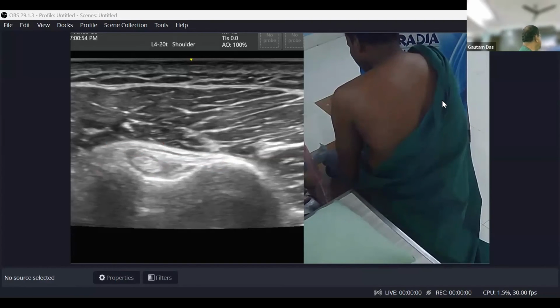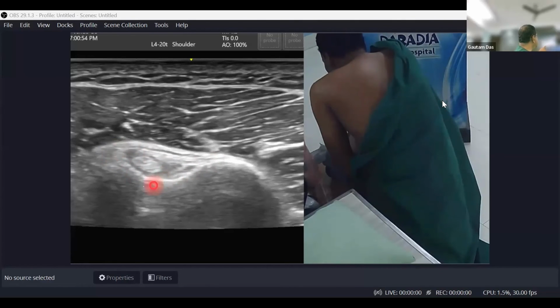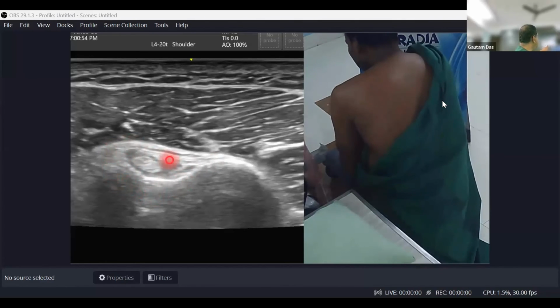And if we have bicipital tenosynovitis, or a lot of fluid collection or effusion inside the glenohumeral joint, the synovial sac projects out into the bicipital groove around the bicipital tendon. So with any effusion, the black area around the bicipital tendon that you can see here will increase in amount. This white line from here to here is your transverse humeral ligament.